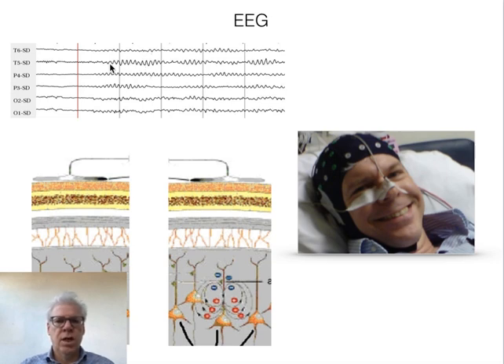And the source of the EEG is mainly the pyramidal cells in the cortex that are aligned in parallel, and each pyramidal cell essentially functions as a very small current dipole, creating very small extracellular currents. But as there are so many in parallel, the current is typically large enough to induce significantly large voltage drops across the scalp that we can measure. And another important characteristic is that they oscillate, they fluctuate.